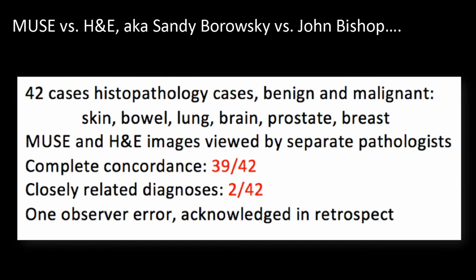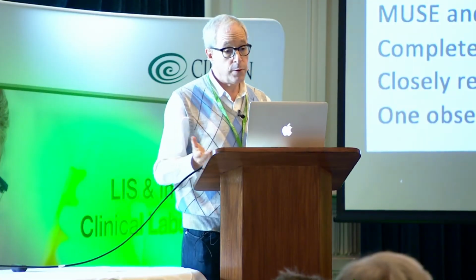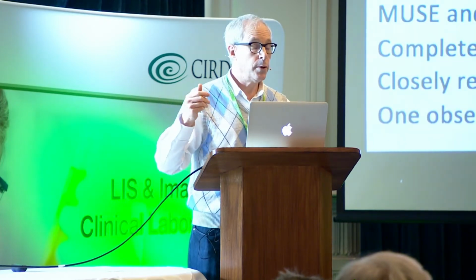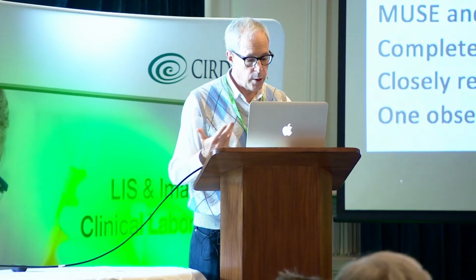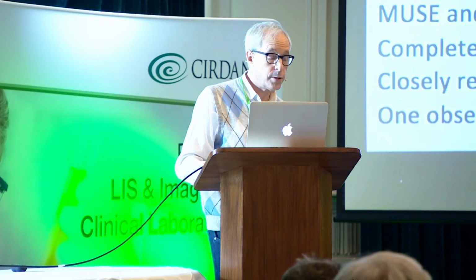So what this means, just in workflow, is that you can get a diagnosis in minutes instead of days. If you can imagine how that might play out in various workflows, not only for frozen sections, but simple patient management: get a biopsy, and you know right away whether it's cancer or not. You can send the patient home.